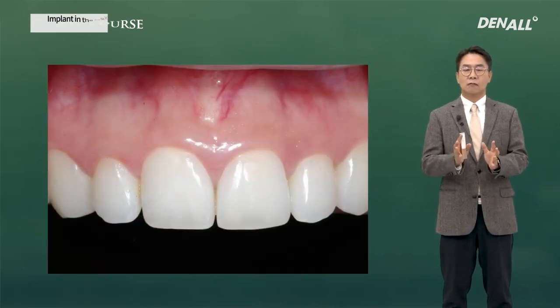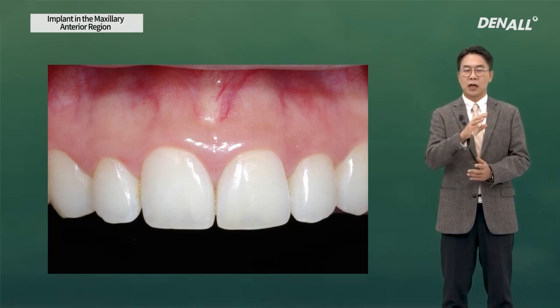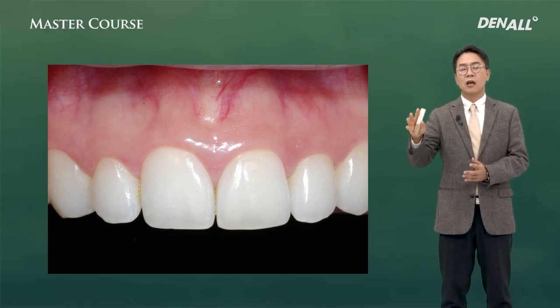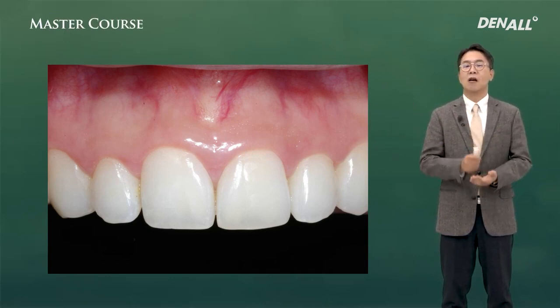When gingiva is very healthy and the teeth look squared, we need to look at the teeth and the gingiva. The gingiva contour looks very natural, and the interdental papilla area is fully filled.